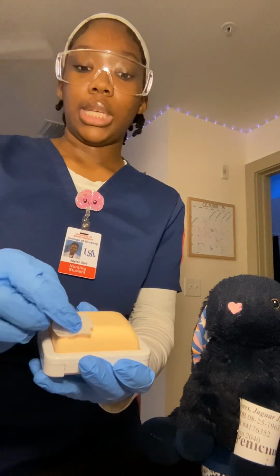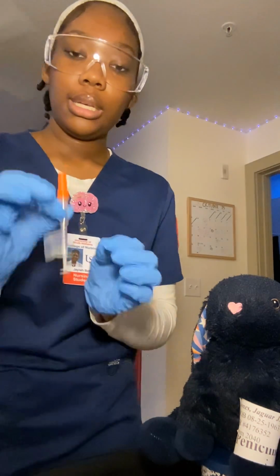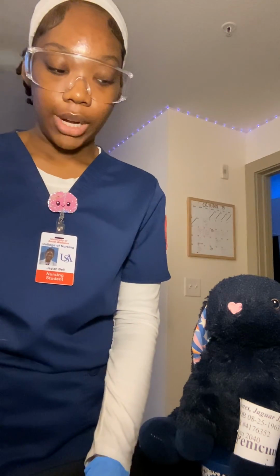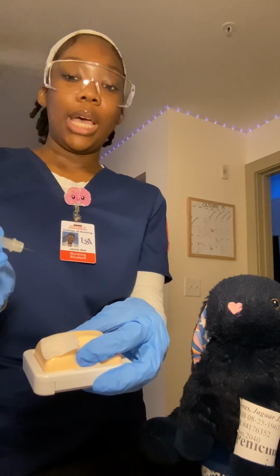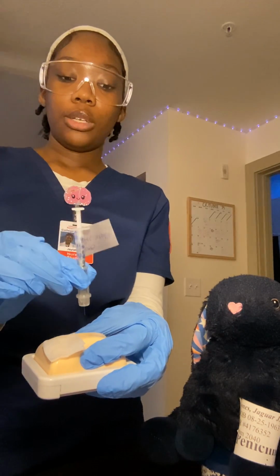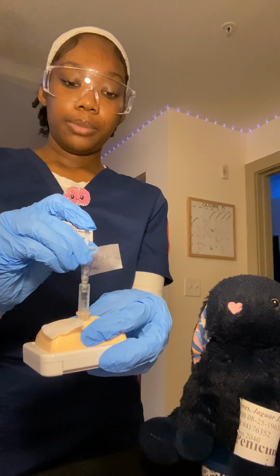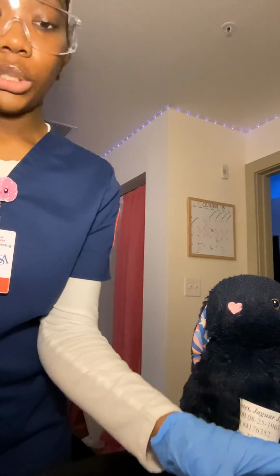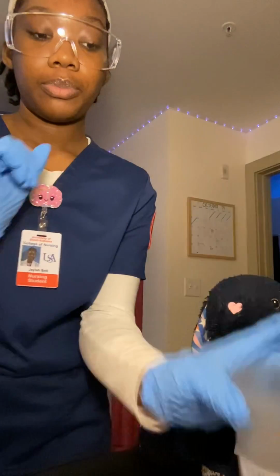Alright, I'm just going to lay this on the side here. Okay, now I'm going to take my needle. Alright, Mr. Jones, I'm going to go ahead and pinch your skin. Like so, since this is subcutaneous, and I will be inserting this needle 45 to a 90-degree angle again since it's subcutaneous. 3, 2, 1. Alrighty. Go ahead and inject that. Alright, good job, Mr. Jones. You did a great job. Just want to show y'all I am putting the needle in my sharps container along with the top.